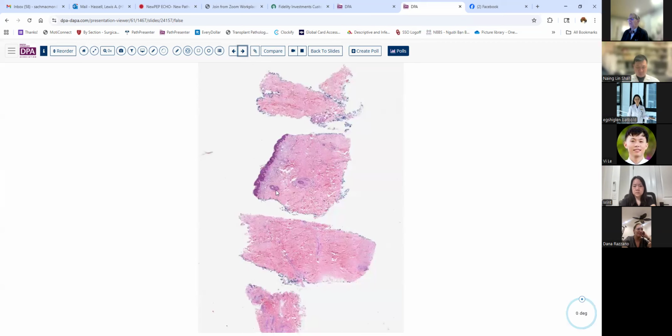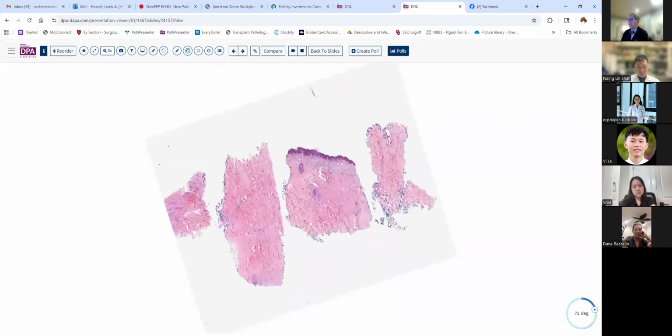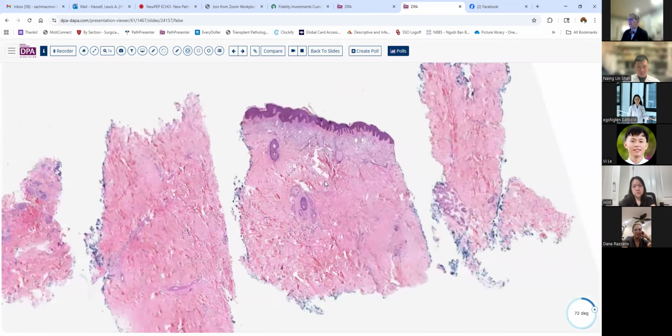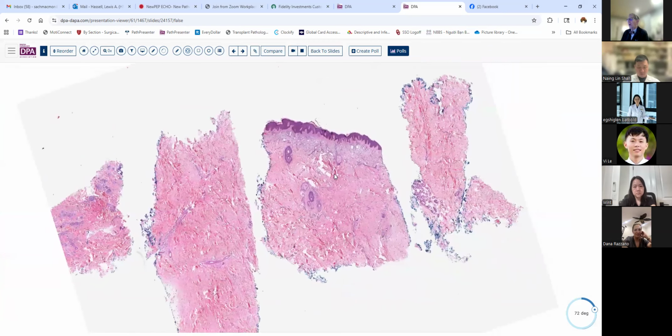All right. Well, here we're going to move on to another fairly common disorder in skin pathology. And this is maybe not the best slide, but let's start at low power. So where are we on the body? We've got hair follicles. We've got a fairly thickened epidermis. It's not that real thin sort of thing. So either it's a younger person or maybe a site like the back.